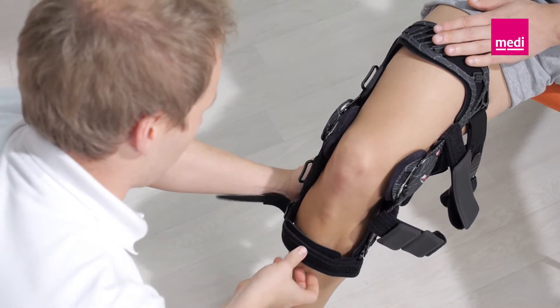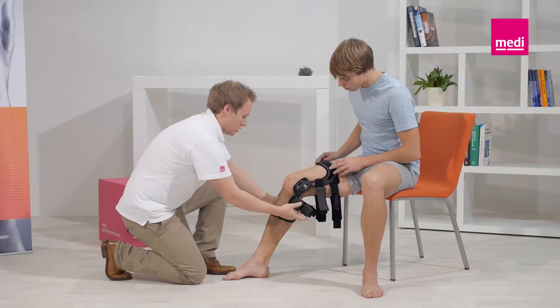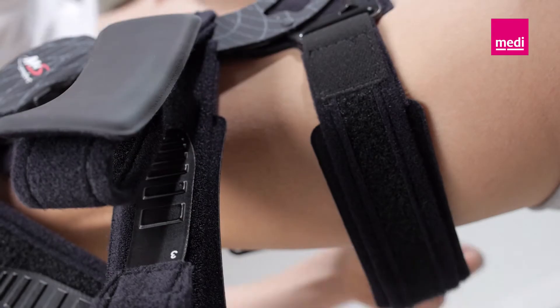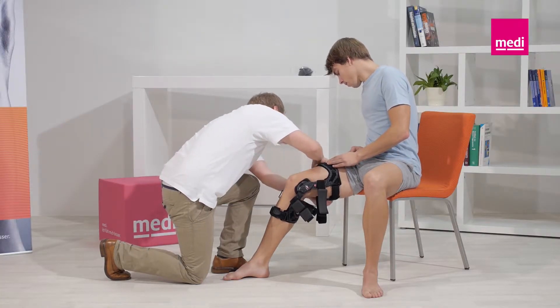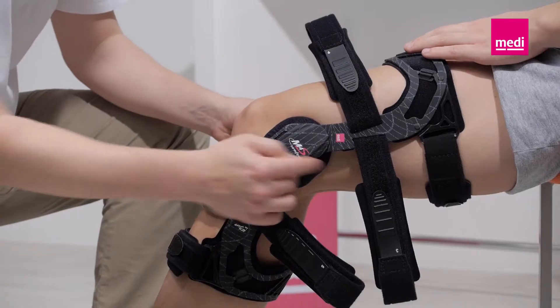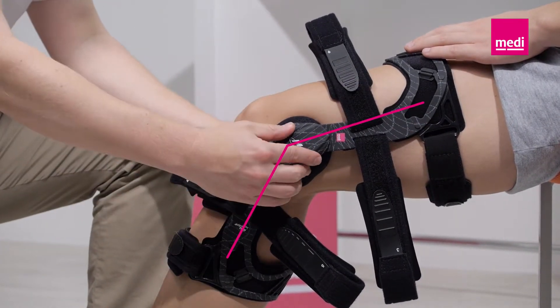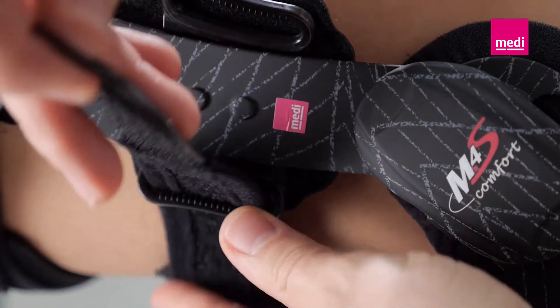The straps should be secured in the order specified by the numbers to guarantee the orthosis fits securely and has the optimum effect. Start with straps one and two. The knee should stay bent. Now push both orthosis hinges backwards towards the back of the leg. Make sure that the hinges are positioned behind the lateral medial midline of the leg. Now fasten straps three, four, five and six.